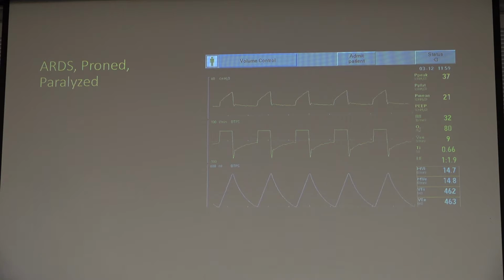Again, we've sort of talked about some of these things. Just looking at the waveforms, so a second is from here to here. This person's inspiratory time is about 3/4 of a second. And unless we're giving 800 cc tidal volumes, that person's flow is probably pretty low. And again, if we look at the flow tracing, we can see flow is significantly less than 60. And again, this person doesn't have asynchrony because they're paralyzed, so who cares about that flow?